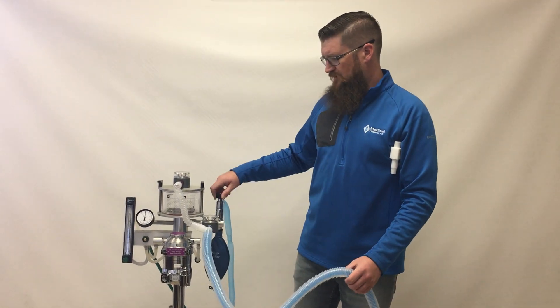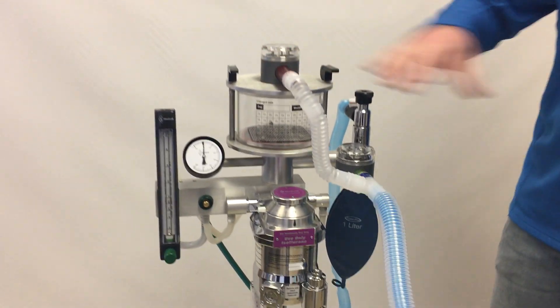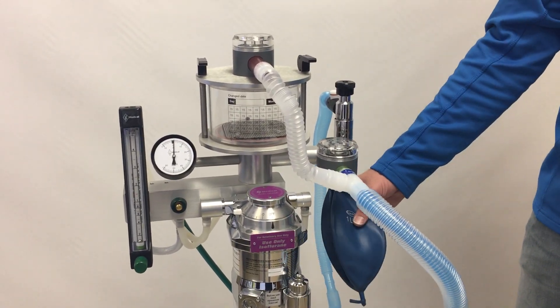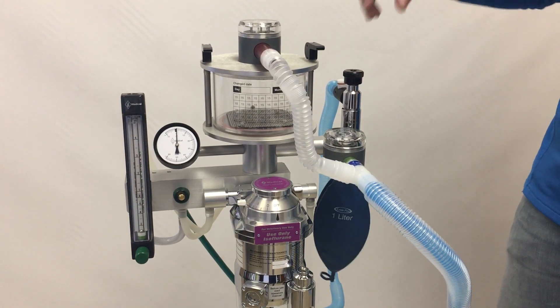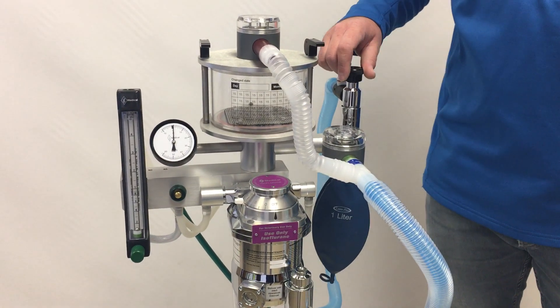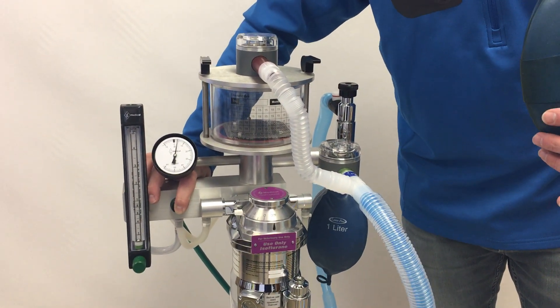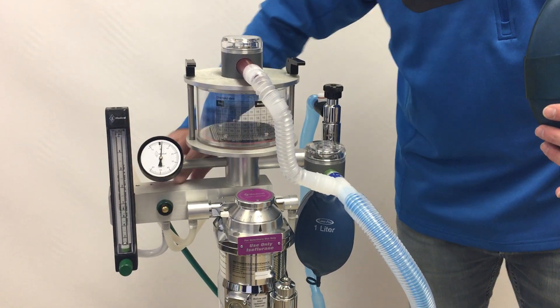With no safety relief valve installed, we have a breathing circuit on the machine and a bag in place of the patient, set up on the bag port of the anesthesia machine. With the pop-off valve open, we'll see that no significant pressure builds up in the machine — just a little bit of back pressure.